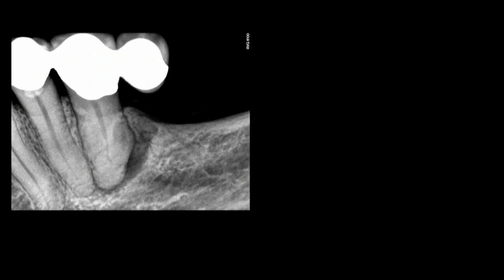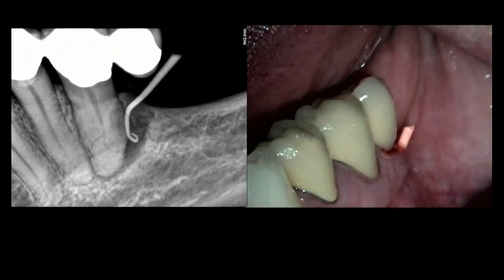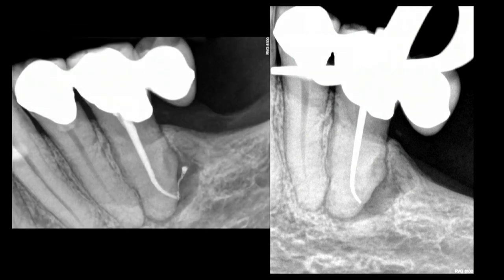And so let's take 7 quick examples, just simple examples of 7 in a row kind of thing, nothing exotic. And you can see there's a mandibular premolar lesion of endodontic origin. It tests non-vital. Sinus tract traces to the exit, no doubt. And here's the cone fit. And the next picture, of course, is going to be the finish.